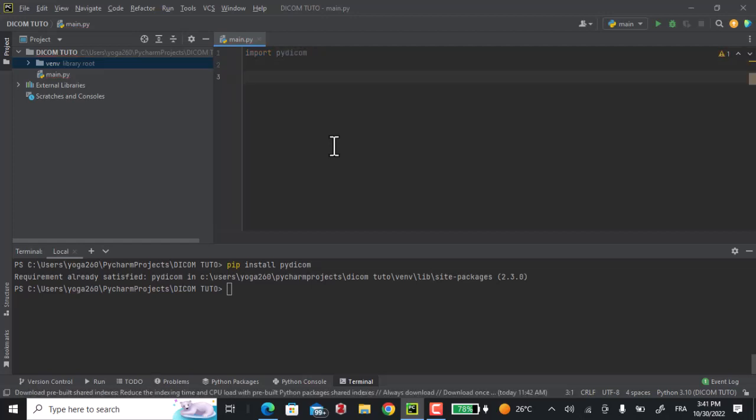It would be better to make your code in a virtual environment. That will prevent breaking your other projects in case you need to upgrade the package. I'll try to keep these things as simple as possible. Even if you have no coding experience, you can easily understand what we're doing in this tutorial, okay?